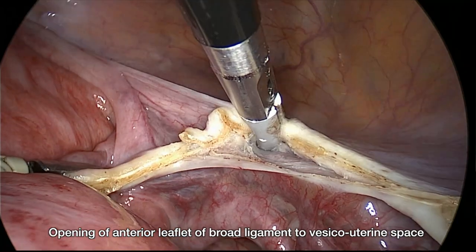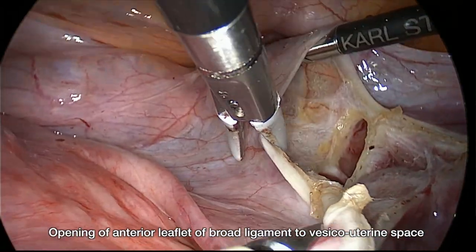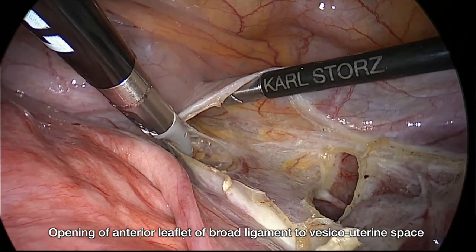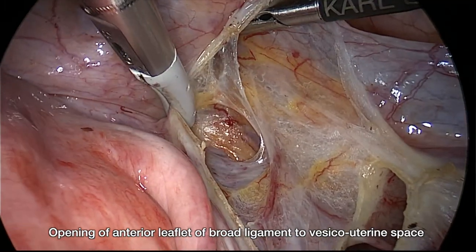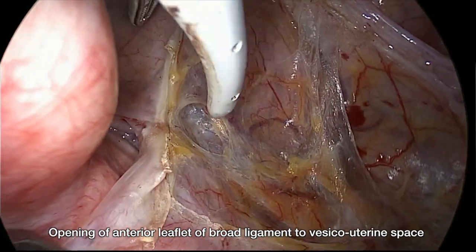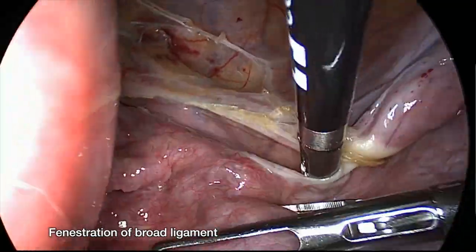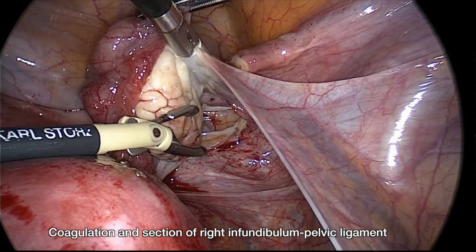We open the anterior leaflet of the broad ligament up to the vesico-uterine space, then open the peritoneum parallel to the infundibular pelvic ligament, followed by coagulation and cutting of the right infundibular pelvic ligament.